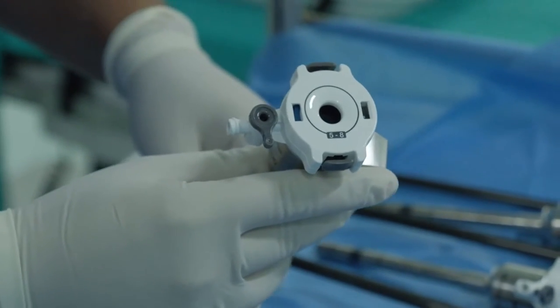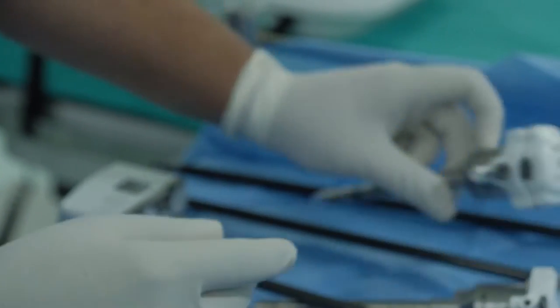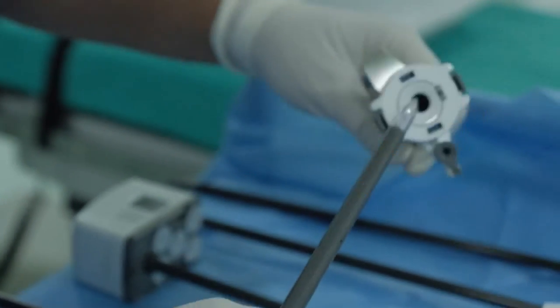The robotic system also provides us with 5 millimeter instruments. This is an optical obturator which is used to insert the trocars.